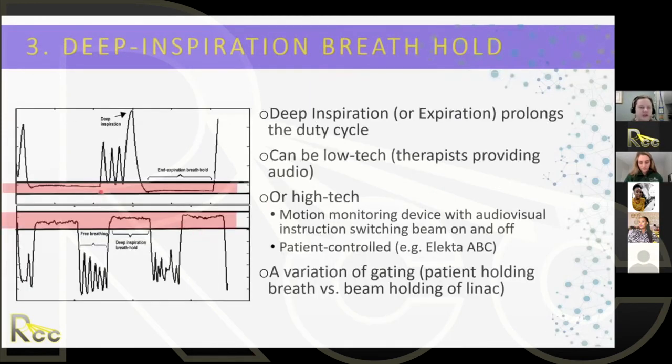So usually when breath hold was first instituted, we had big debates. Is it better to hold the breath on the inhale or on the exhale?